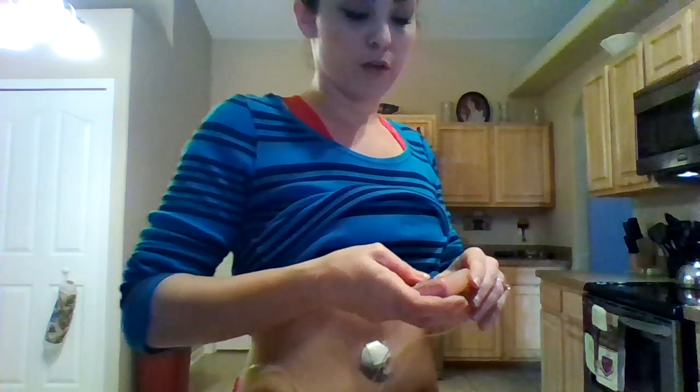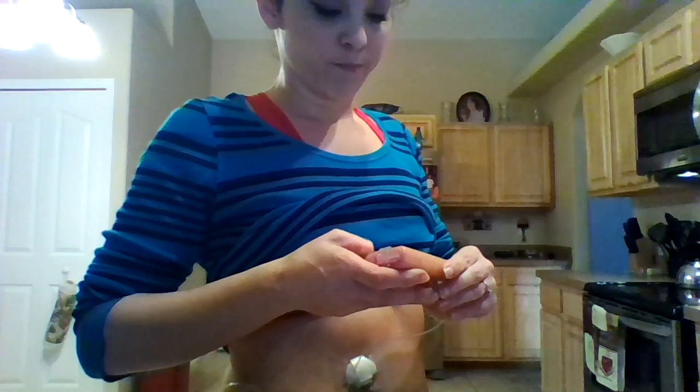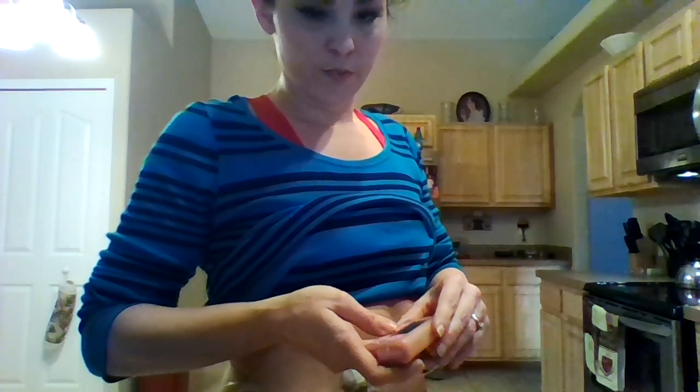Now what you have to do is go into your pump and link it to your sensor. I don't know if you guys want to know all this part, but I'll share with you anyway. Why not? If not, then stop the video now because there you go, it's inserted.